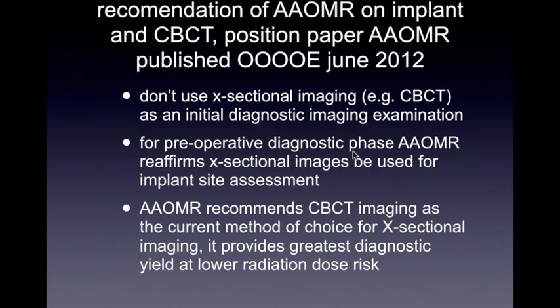In terms of when it could be used or better used, the American Academy of Oral and Maxillofacial Radiology way back in 2012, and this hasn't changed as much, has pronounced that in determining when CBCT would be a better option as compared to, let's say, our periapical radiographs and other radiographic modalities, the principle of ALARA, as low as reasonably achievable, still takes effect.